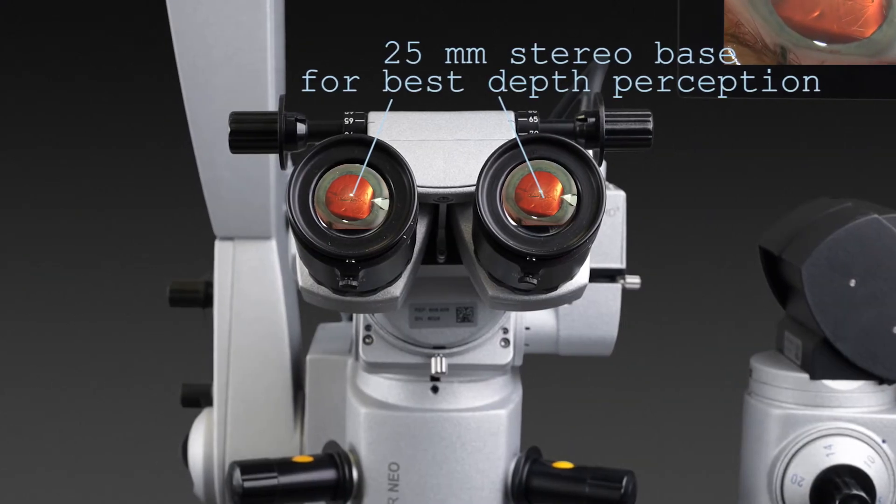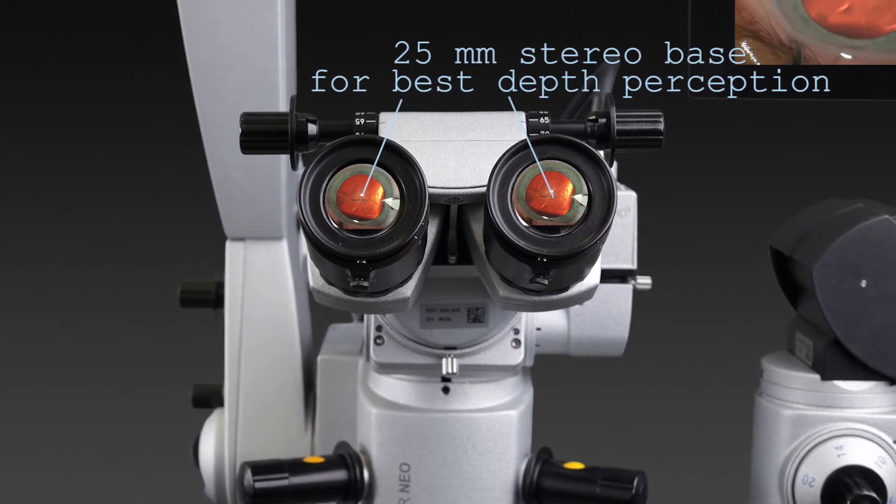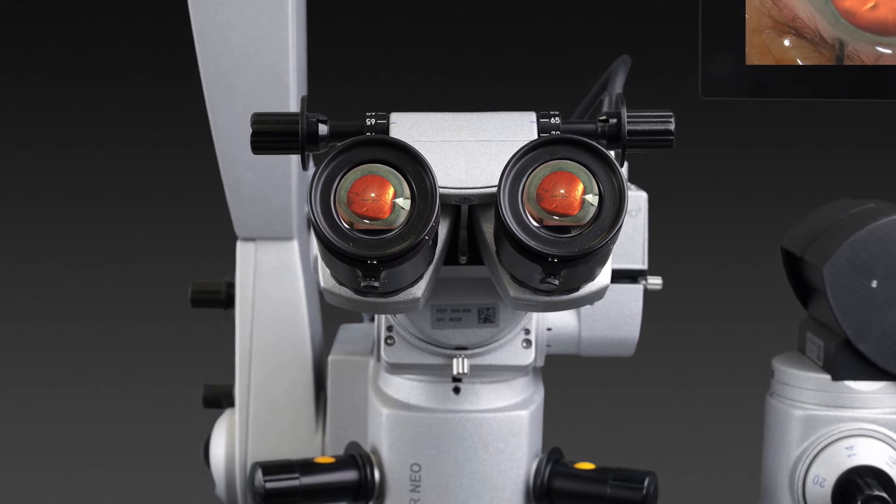The HS-HIR Nio 900A allows superior judgment and treatment with best depth perception and three-dimensional vision, due to its 25mm stereo base.